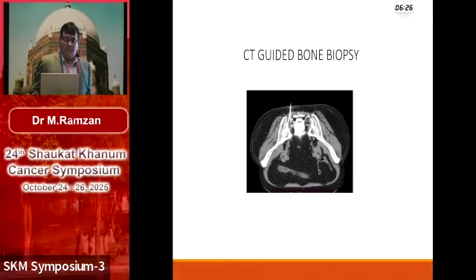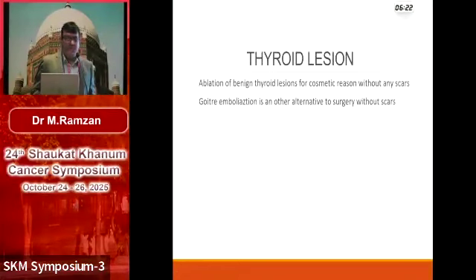We can do bone biopsies under CT guidance. This is the typical example. This next one is something which is cosmetic actually. Especially these days, when you are going for incisions on the neck, it's very important not to have incisions.